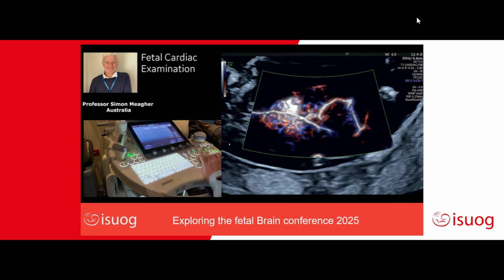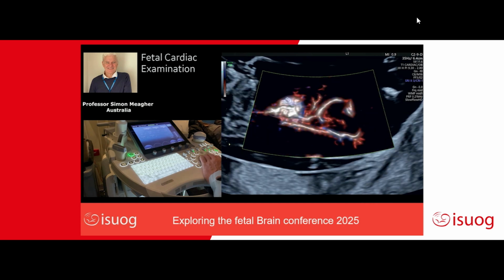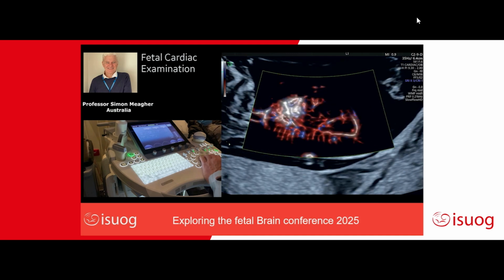And as you do that, you see all these tiny little vascular branching in these vessels as you sweep to the right and the left of the midline of the descending aorta. And it just shows you the power of what you can see with this technology.